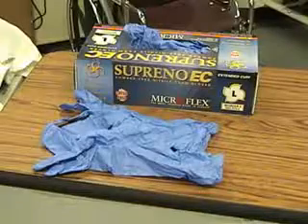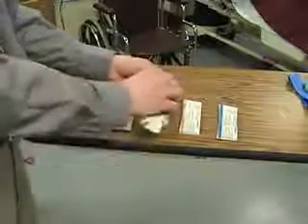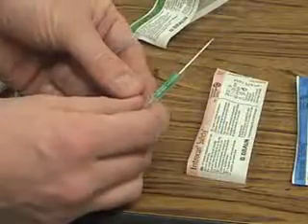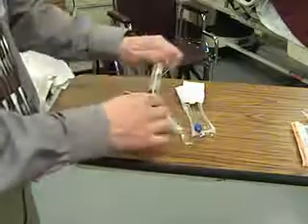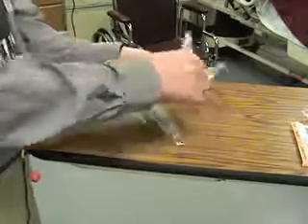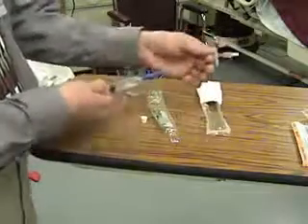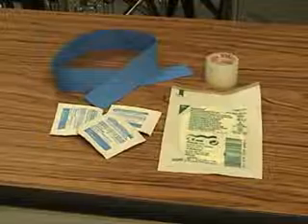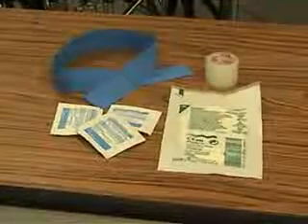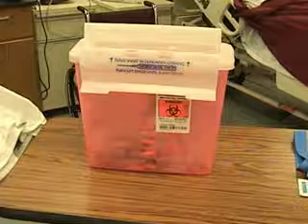You will need gloves, an 18-gauge intravenous catheter, a 6-inch lock and a 10 cc syringe of normal saline. A tourniquet, alcohol wipes, an opsite, tape, and possibly hair clippers. Make sure that you have access to a sharps container for disposal of the needle.